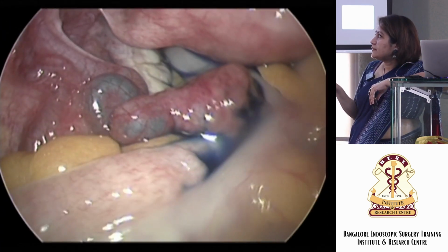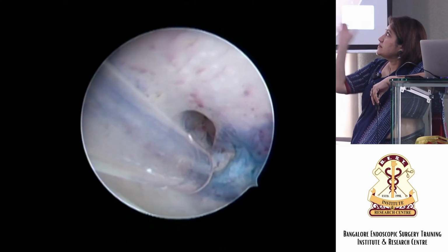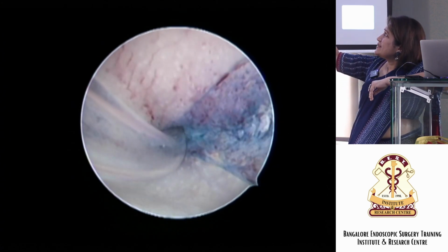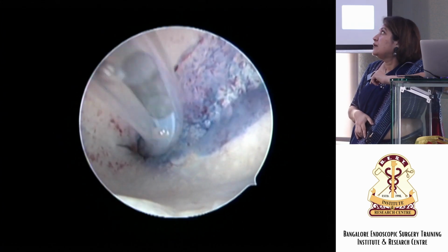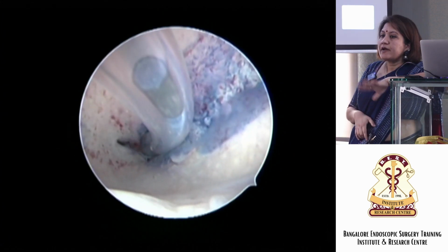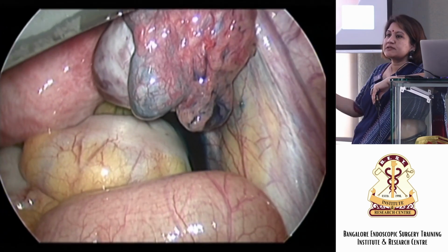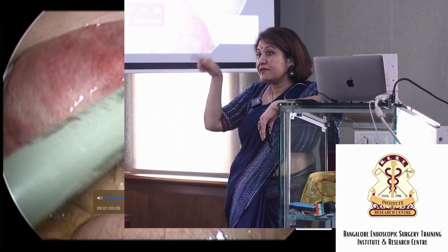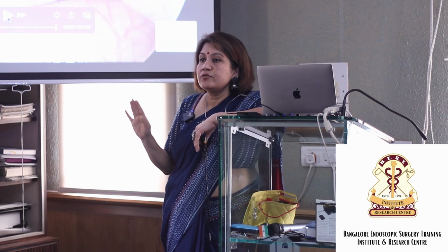So Novi's catheter. A lot of people use all sorts of ureteric catheters and all that, but this is post cannulation, dye coming out. There was a small polyp, if you notice, at the entrance of this. These are the cases which respond well to the cannulation. So this patient also conceived the next cycle itself. I have a lot of people after straightforward cannulation who conceive in the next 2 months itself. So I feel that little polyp was something which prevented it, and otherwise all the other factors were normal in them. So I have now stuck to using only Novi's catheter.